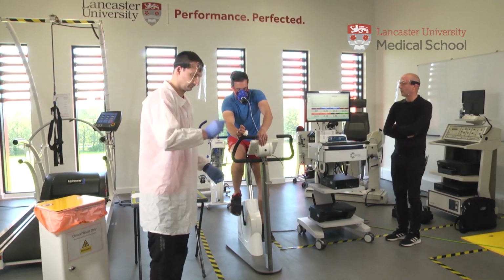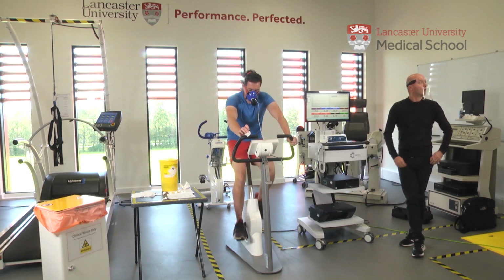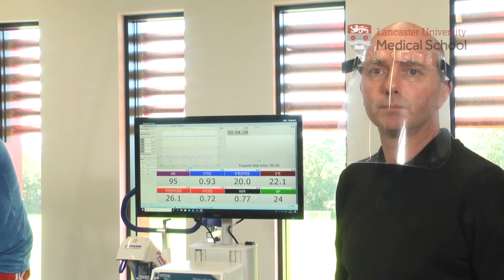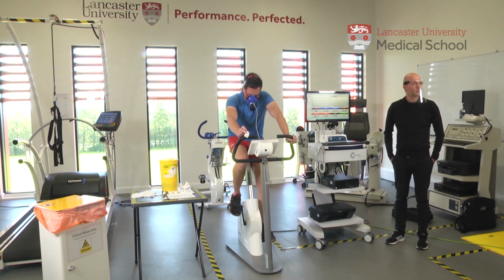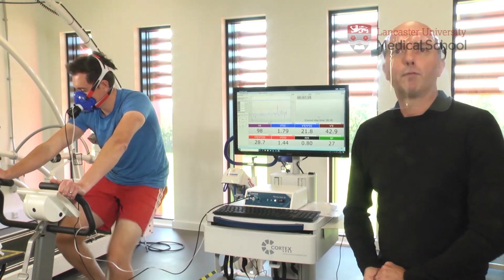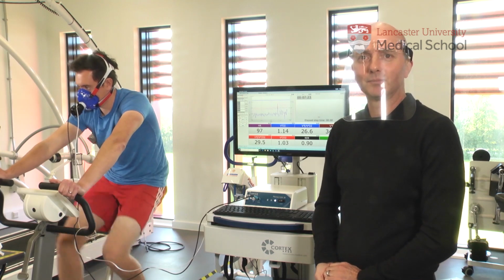Okay, and 4 minutes are up, so second stage, we are moving to 50 watts for this second stage from minutes 4 to 8. Once Jack has taken the capillary sample, he's taken it to the Biosen to calculate the blood lactate. The first measure was 1.4 millimoles per litre.